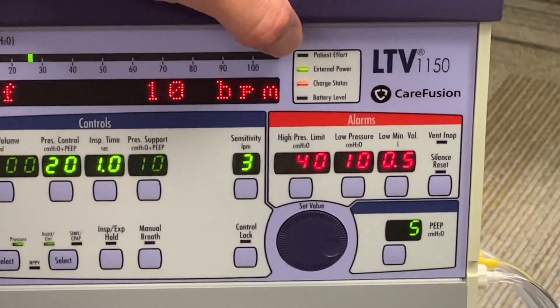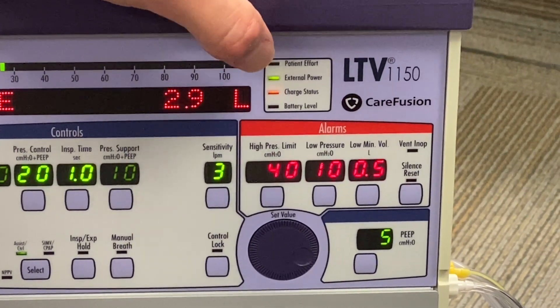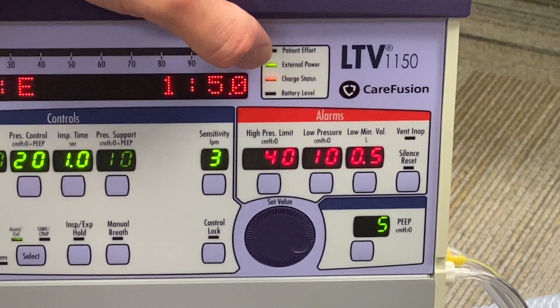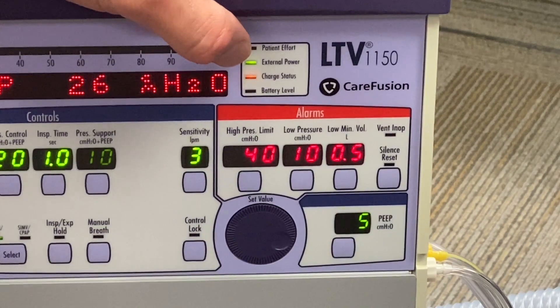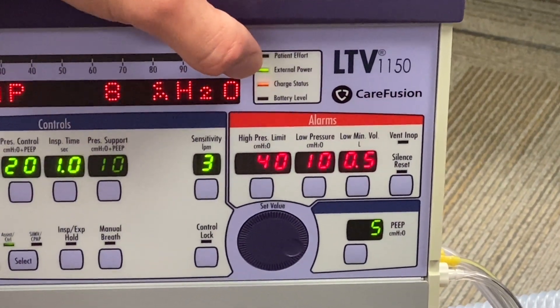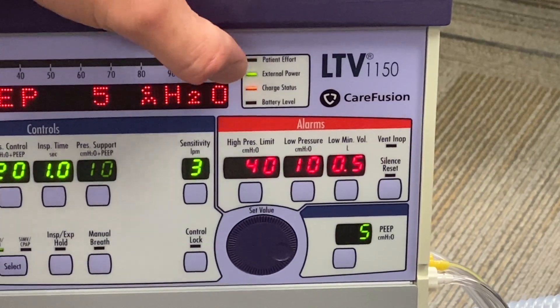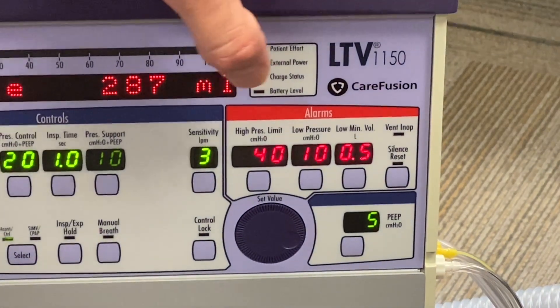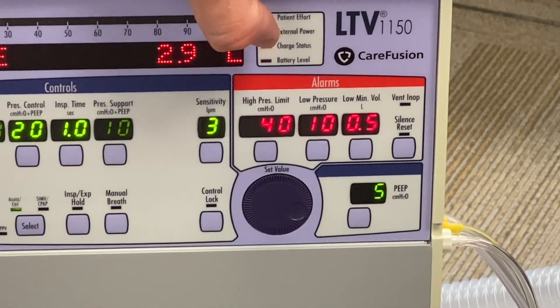Over here it will blink any time there's a patient effort. This indicator shows you that you have an external power source — external power sources plugged into the wall as well as the battery will be indicated here. Anything besides the internal battery will show on the external power source indicator. This is showing we're currently in a charge status; we don't have an external battery plugged in, but the internal battery does require plugging in to charge.